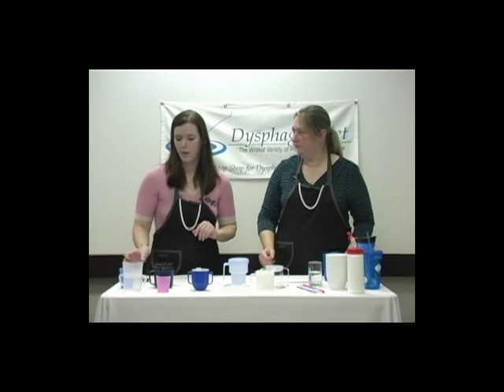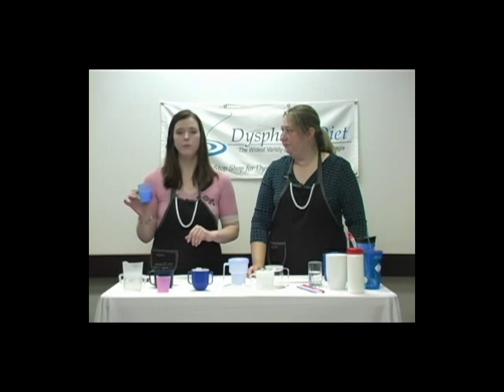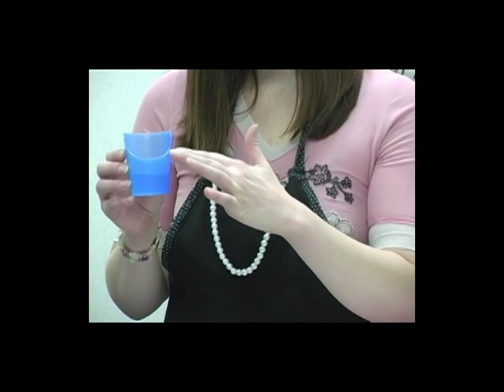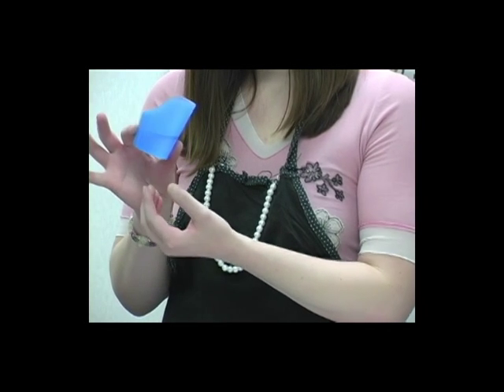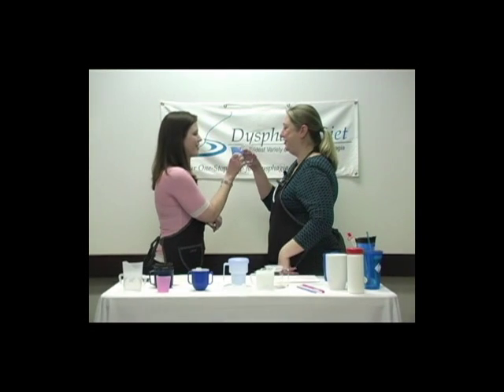And this next cup we've got here is sometimes called a nosy cup, and you can see it's got a cutout for your nose. So a person would not have to tilt their head back as far when drinking out of this cup versus a regular cup. Cheers. Cheers.